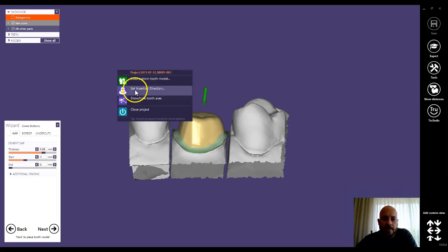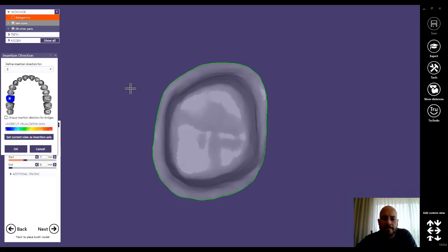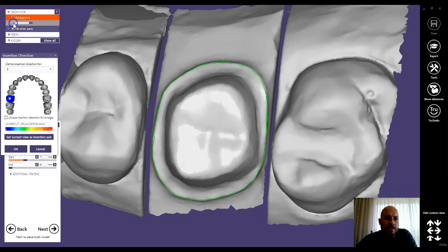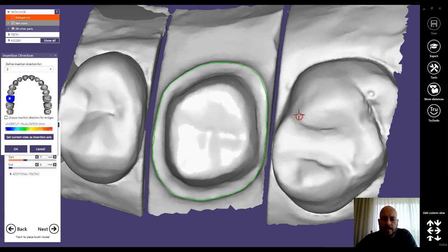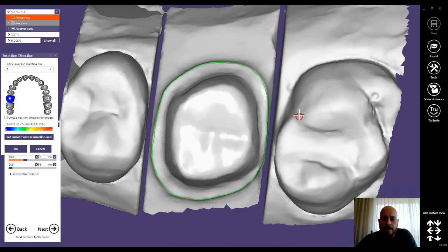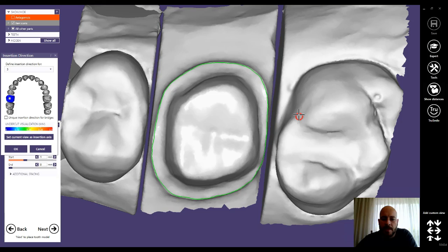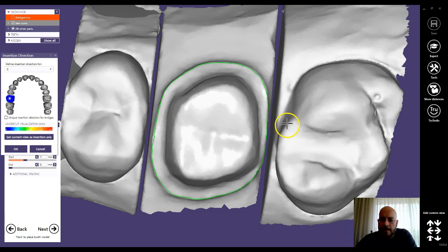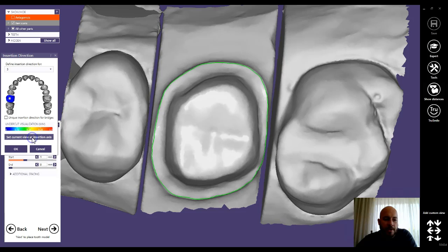You can do the quick correction here. Right-clicking the background, go to set insertion direction. And I also like to make sure that the jaw scans are showing up, and I can make a slight correction here to make sure I'm getting an equal on both the mesial and the distal areas. I'll set the insertion direction, for example, right here.